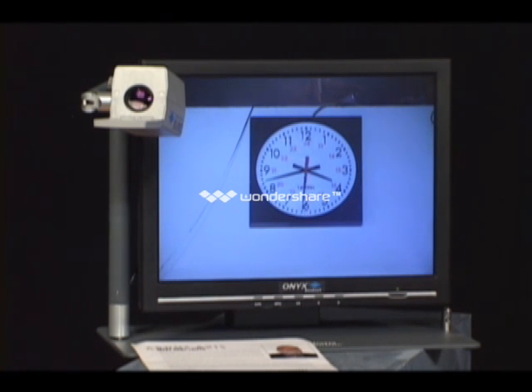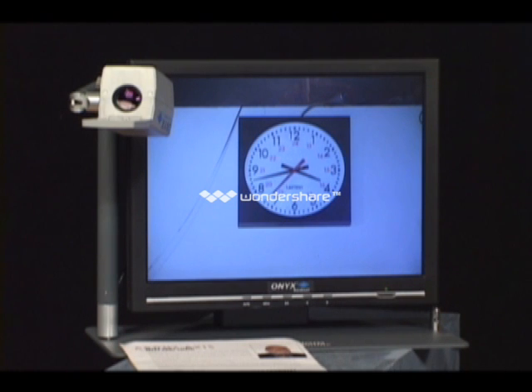Now, the thing about this unit is if you point that at the clock or something, we can also flip this image any direction we want. So the other advantage of this is, supposing we have a group in class and we're all working on a big project. Maybe we're designing something, or making a big wall poster, or something that's going to go up on a bulletin board.